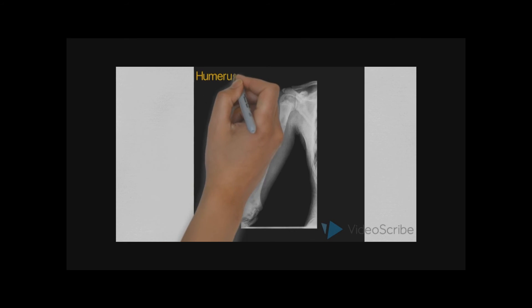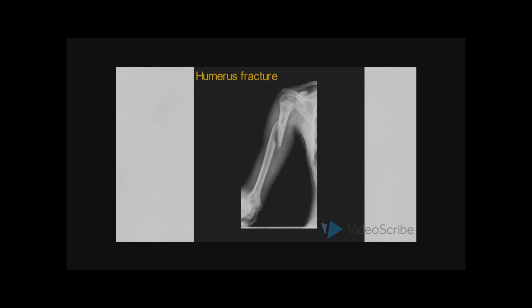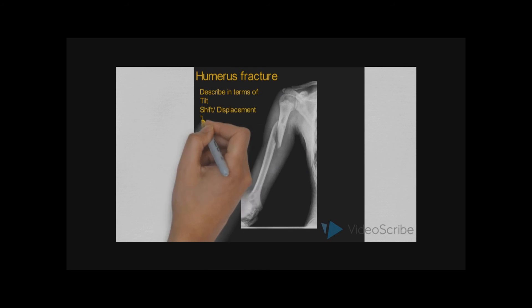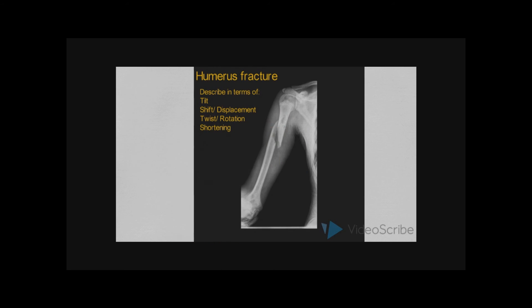We then move on to describing fractures of the humeral shaft. When describing any fracture, we need to assess the following parameters: is there presence of tilt, twist, shift, or shortening in the fracture. Tilt describes the degree of angular displacement with respect to the most distal component of the fracture. Twist describes the rotational displacement of a fracture; fractures with evidence of rotational displacement usually correlate with high-energy injuries. Shift describes translation of the distal fracture segment in the medial, lateral, anterior, and posterior plane. Shortening describes a reduction in the distance between the proximal and distal margins of a bone.